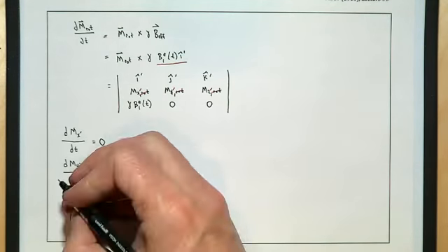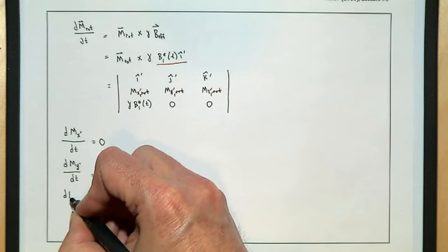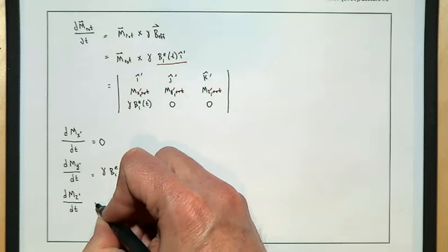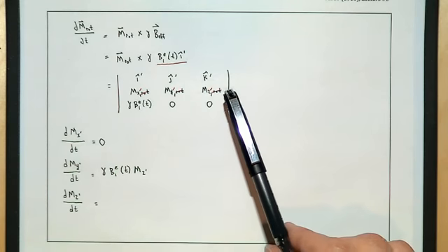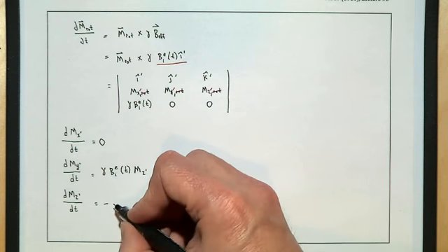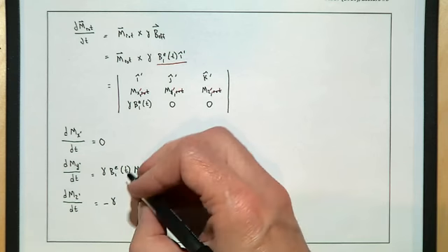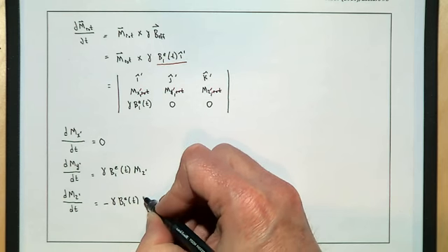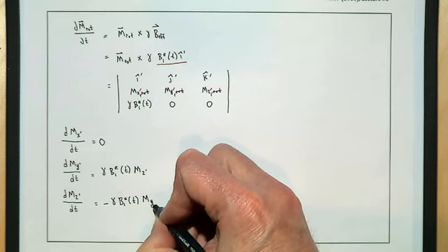And then the last thing we need to write is what happens to our Z magnetization. So dMZ prime dt. And that just comes out of the last multiplication here, but you have a minus sign from the cross product determinant term, and that's minus gamma B1E of T MY.